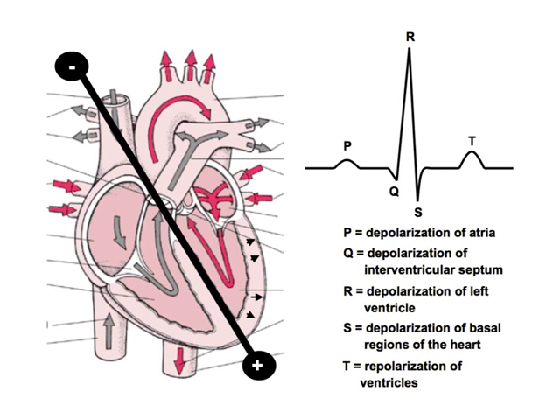We're only ever monitoring along this thick black line, but the information that we can pull out of just this one axis is pretty impressive, and that's shown over there on the right-hand side. So the readings from just this one lead, this pair of electrodes, are shown on the right-hand side.